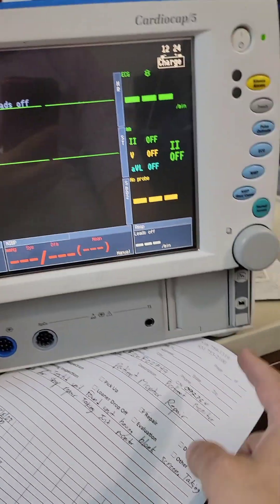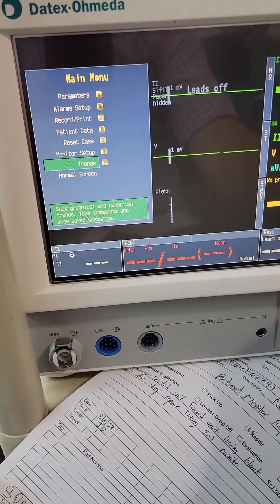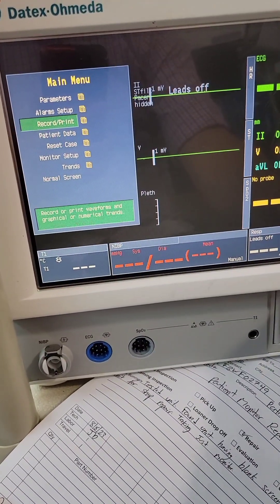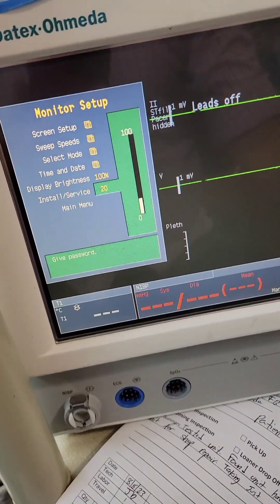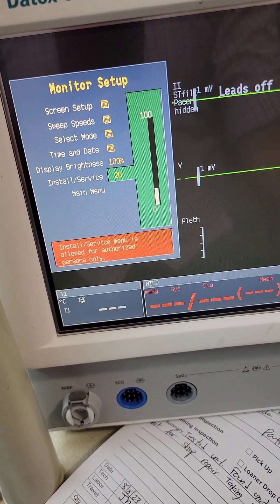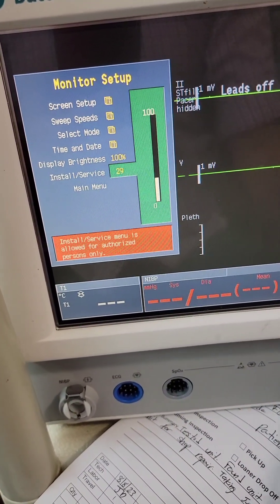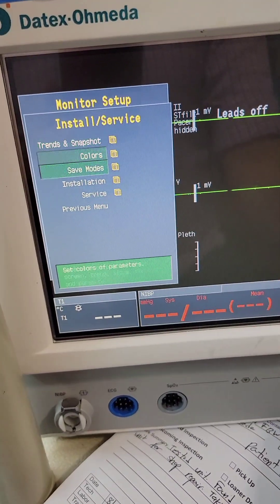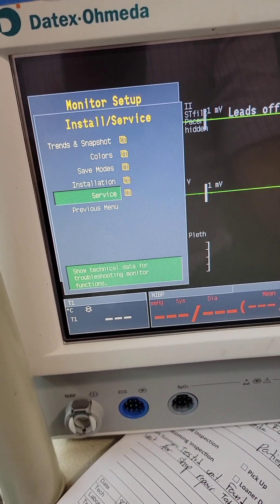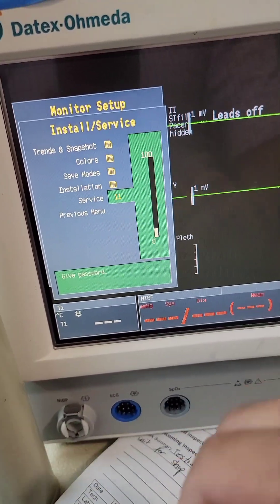From the home screen, push that and get this. Turn this. Go to Monitor Setup, then go to Install Service. Passcode is 16434. Now in here, go to Service. This one is 26, 23, 8.